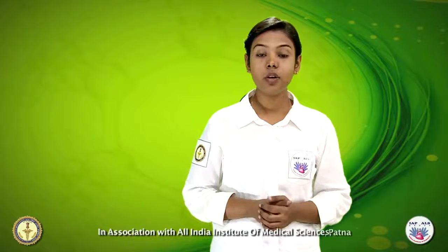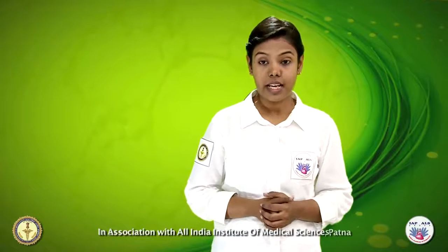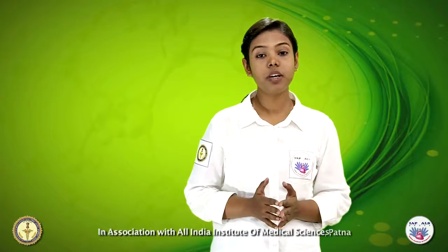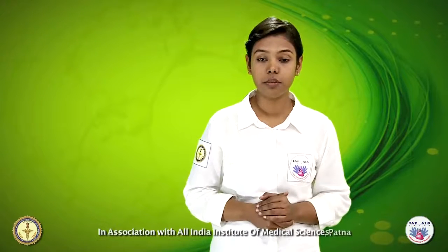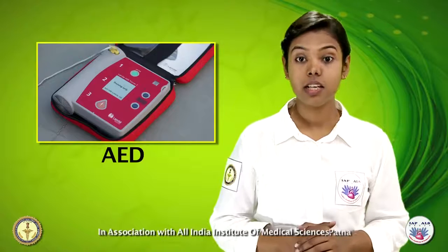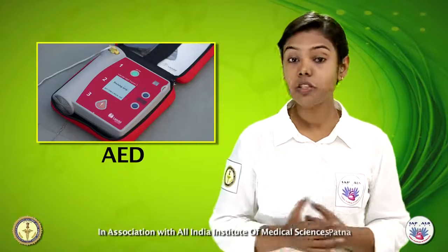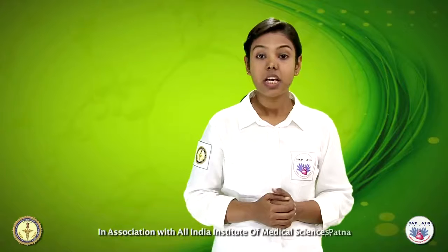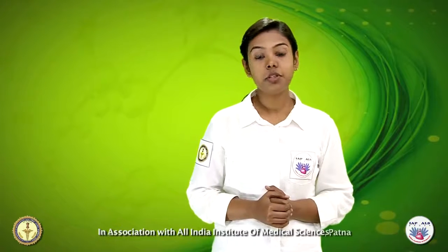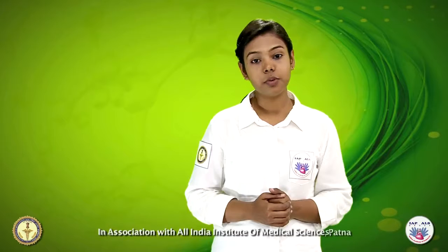Now, let us see how an automated external defibrillator works. The advantage of an AED is that you don't have to worry about recognizing a shockable rhythm. Automated external defibrillator, or AED, is a device that analyzes the rhythm and assesses whether the patient needs a shock or not. If the rhythm needs a shock, then the machine gives you a prompt to press the shock button and the shock will be delivered.